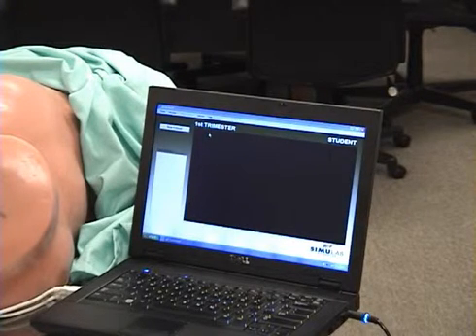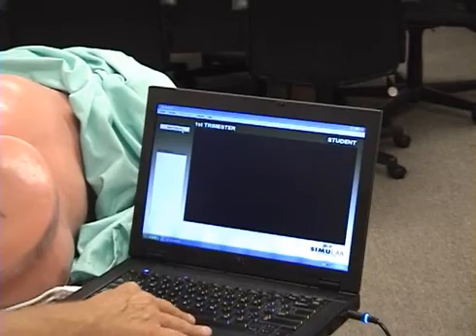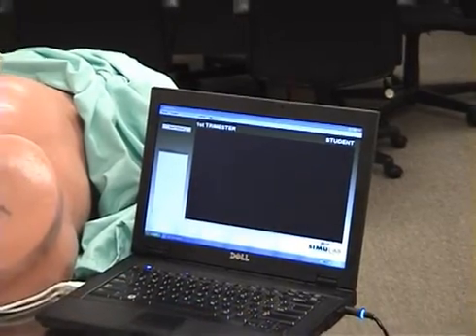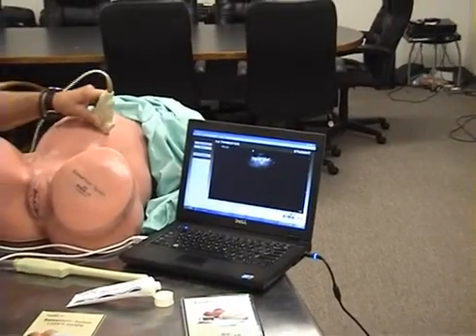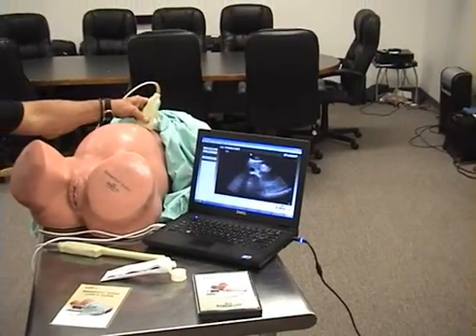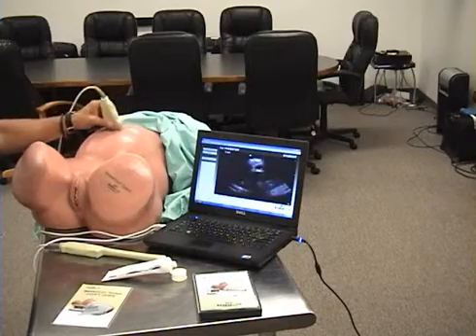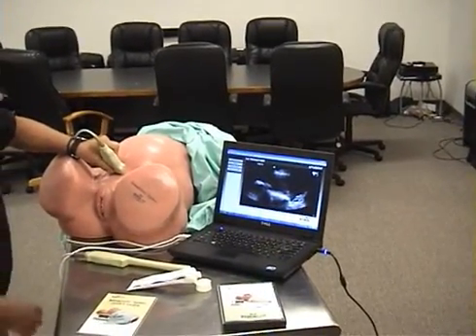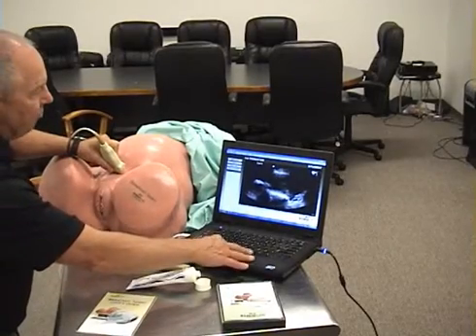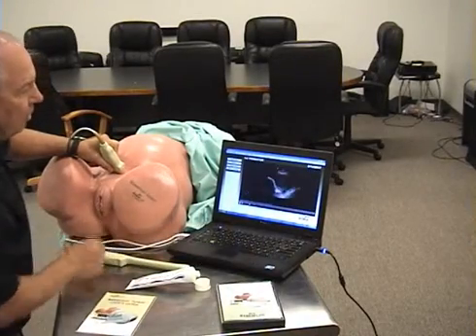So in this case right here, we press on New Patient. We then move the probe across the body. This is doing an external probe on transabdominal. We move down into the location, and when it comes to the location, then they can see a video.